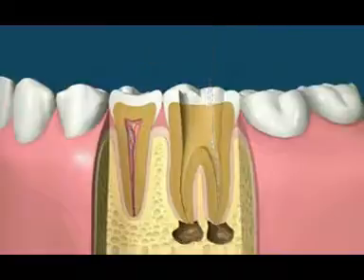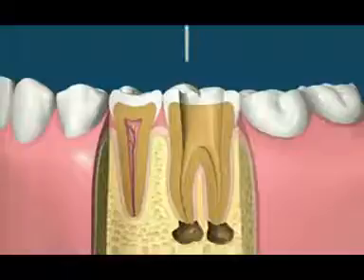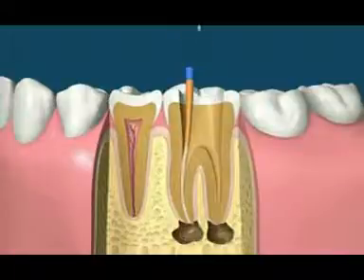Using the manual treatment method of filling the canals involves checking the cone size, then placing rubber cones covered with a liquid sealer into the canals. Once enough cones have been placed, spreading instruments can then be used to compact the cones even further.